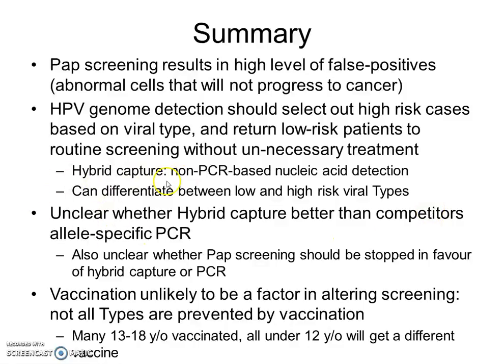So hybrid capture is non-PCR based. It's one of the few techniques that we're studying that is not a DNA amplification technique. What we don't yet know is whether hybrid capture is better than PCR. It's certainly easier and there's less contamination, but we don't actually know what is the best method.